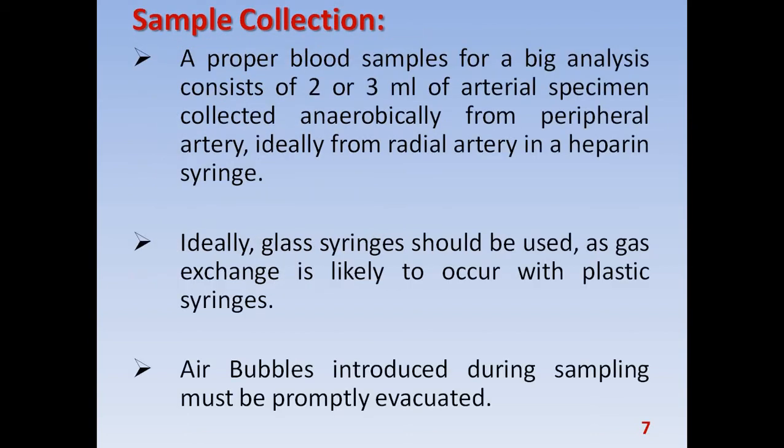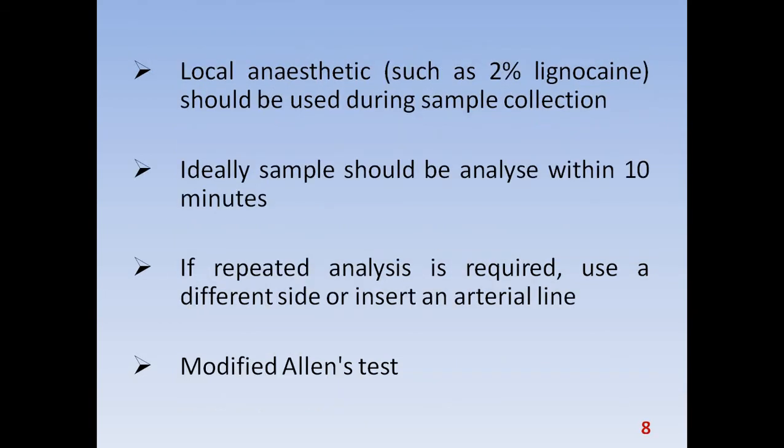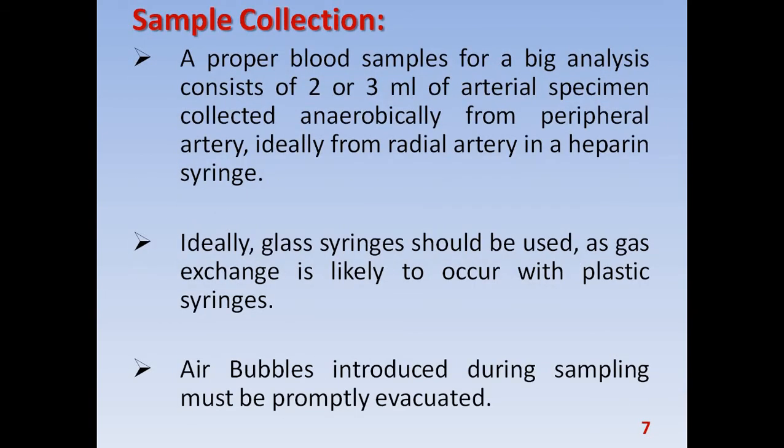Sample collection. Now, before going to sample collection, we have to do the modified Allen's test. Modified Allen's test. Allen's test is the medical sign used in physical examination of arterial blood flow to the hands.